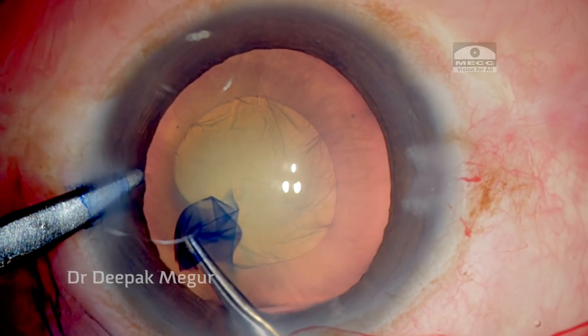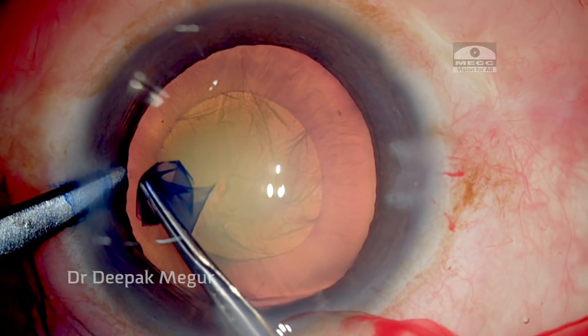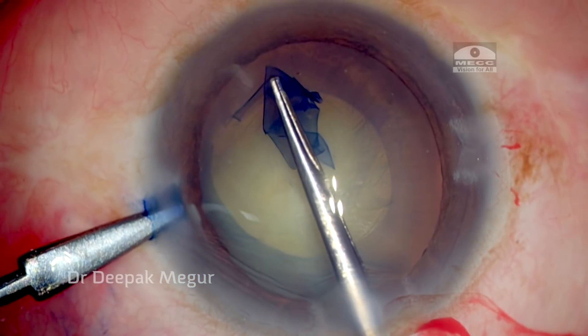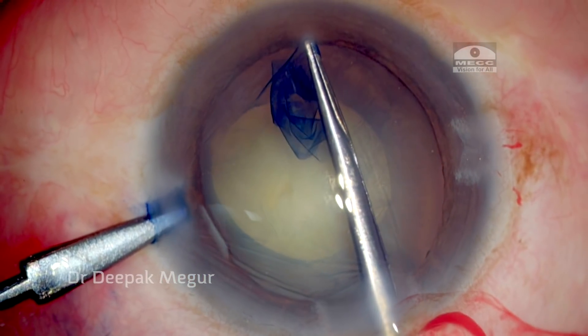I'm aiming for a 5 millimeter capsulorhexis, slightly nasally decentered, keeping into account the temporal subluxation we have. Once we have achieved the 5 millimeter opening, the next critical step is to perform the hydrodissection.